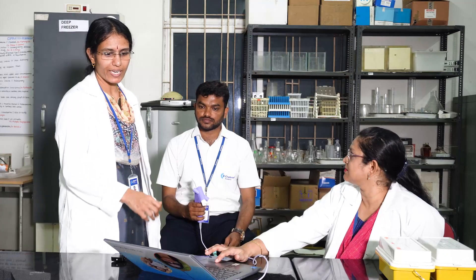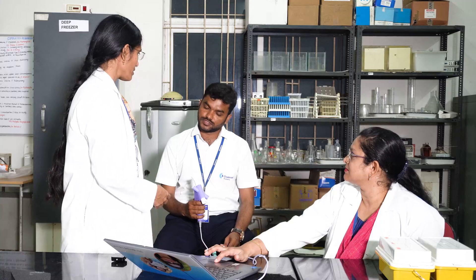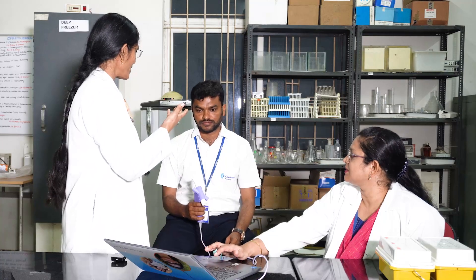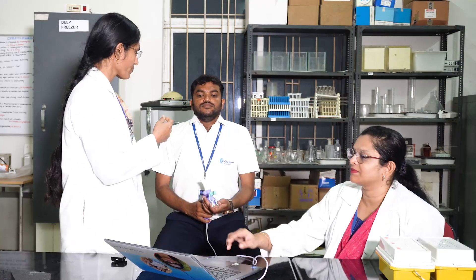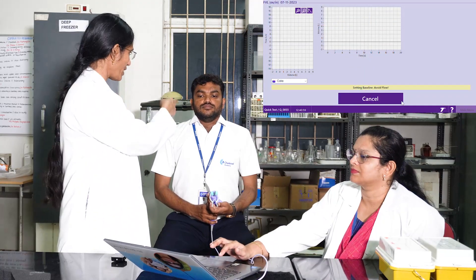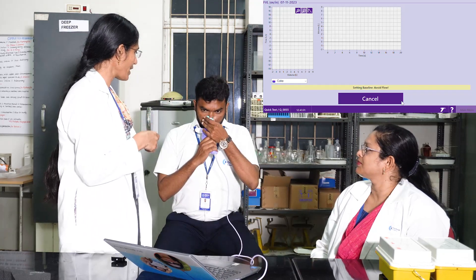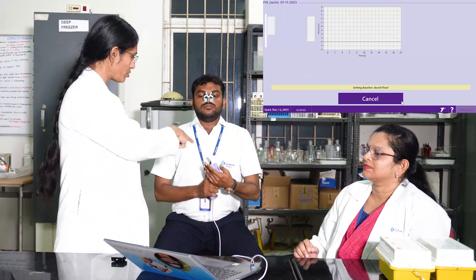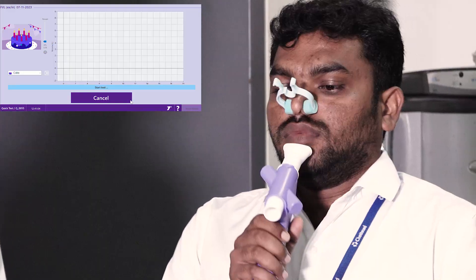Let's do three trials. The first trial — let's start now. Take a deep inspiration and hold. From this total lung capacity, the subject has to breathe through this mouthpiece. Quick.